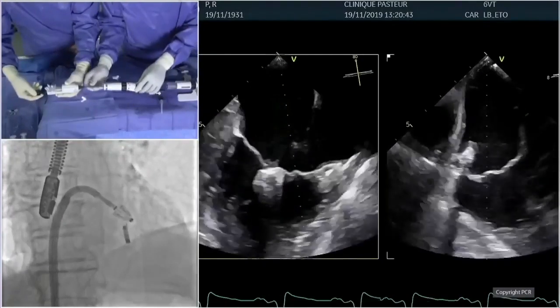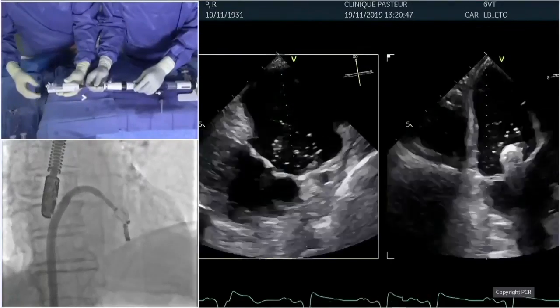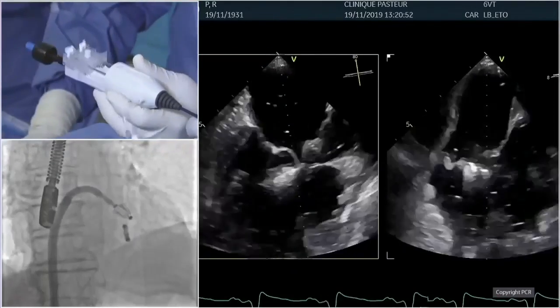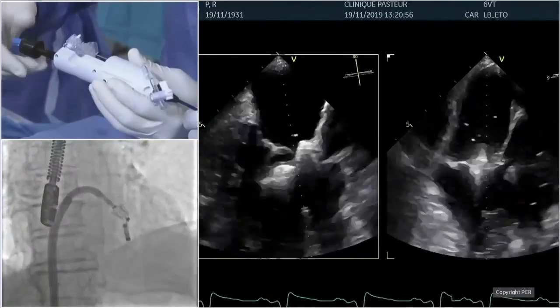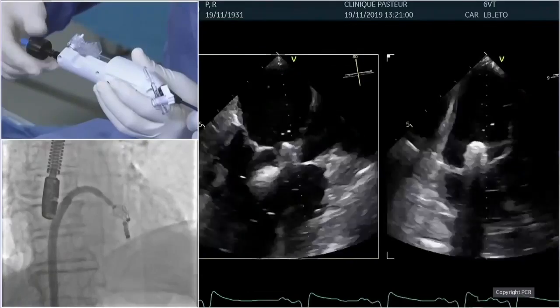I'm going to go to the capture ready, and we are too posterior. We're too posterior now. For the clocking of the second device, do you still rely on a 3D, or do you just make the best out of fluoro now and use the first one as a landmark? I think we can use the fluoro. Yeah, we can use the fluoro just to achieve that.